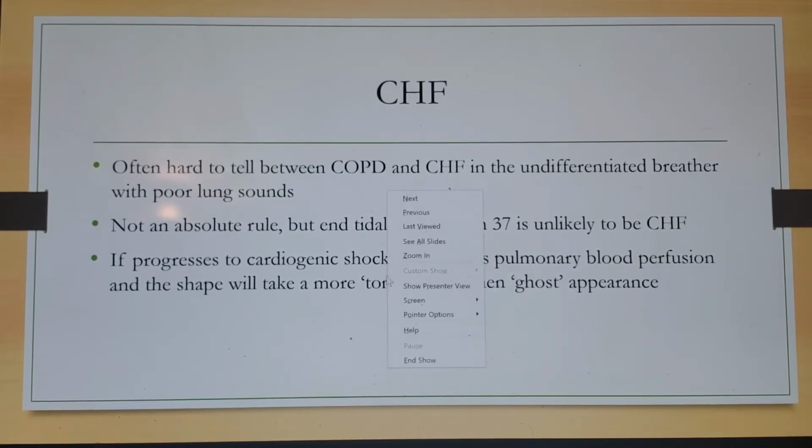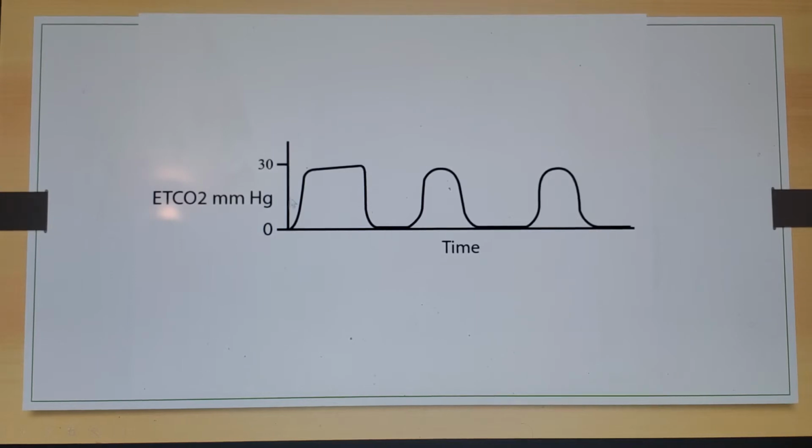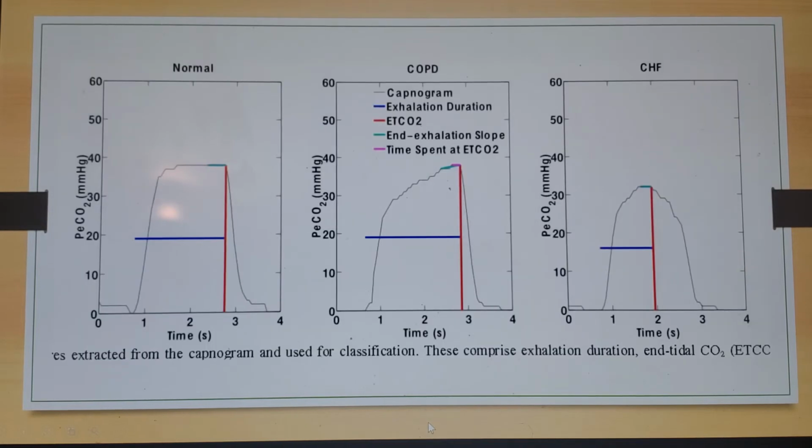So let's look at a couple of those too. So first you got kind of your normal box-shaped waveform, and then all of a sudden it becomes more rounded. I call these like the Pac-Man ghosts. So you have a little Pac-Man ghost there, a little Pac-Man ghost there. So let's go back and look at these again.